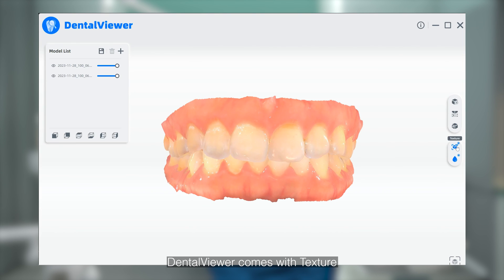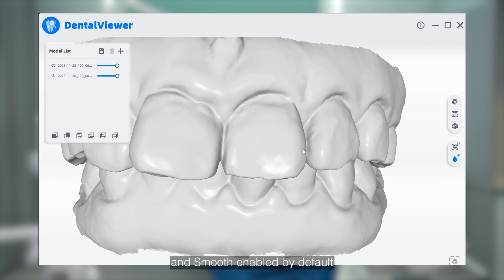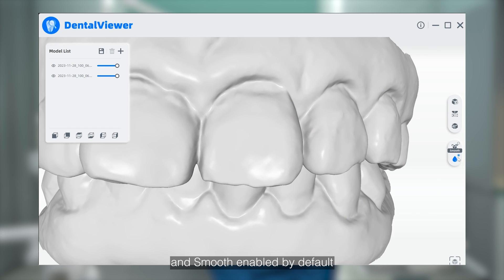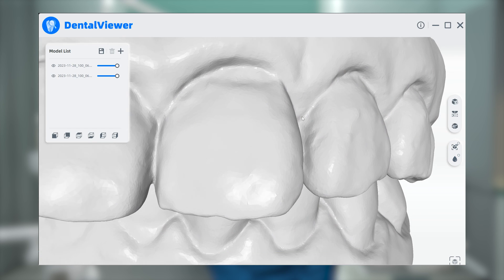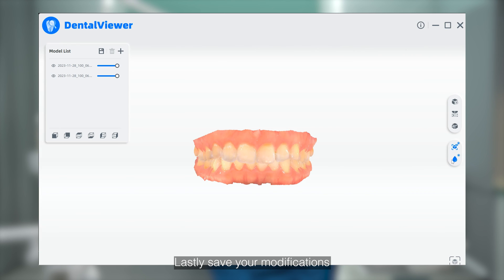DentalView comes with texture and smooth enabled by default. Save your modifications by clicking the Save All Models icon.